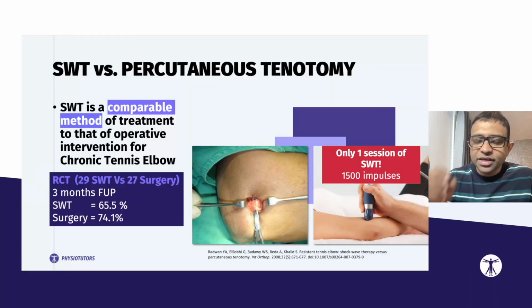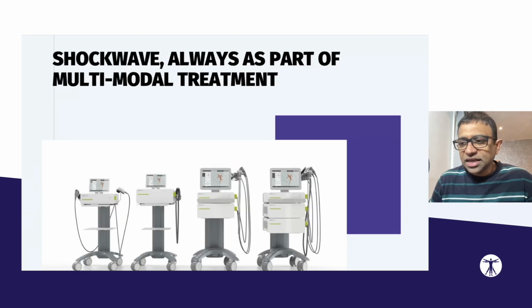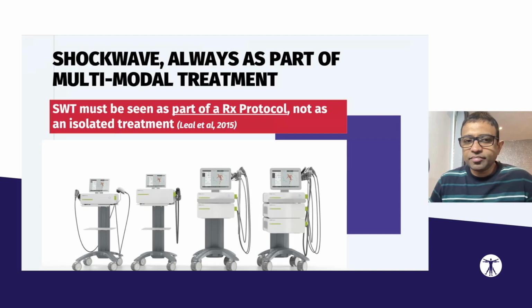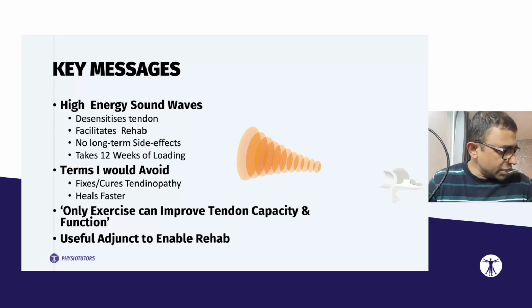One of the key take-home points I want to make very clear is, although I use this modality quite often, it should not be seen as a standalone modality. Shockwave is a safe modality which has been around for more than 40 years. It's used in various branches.